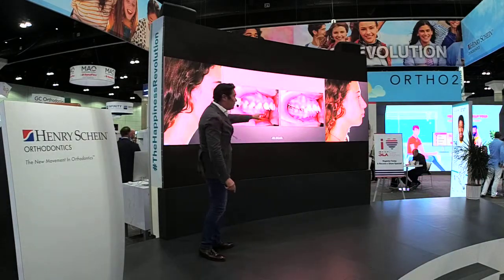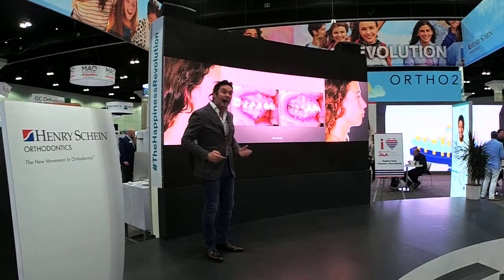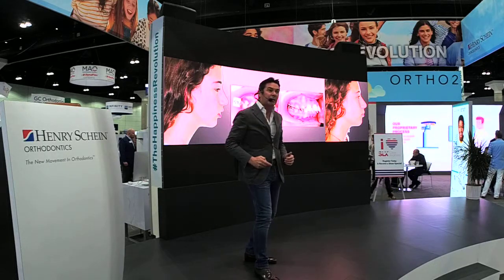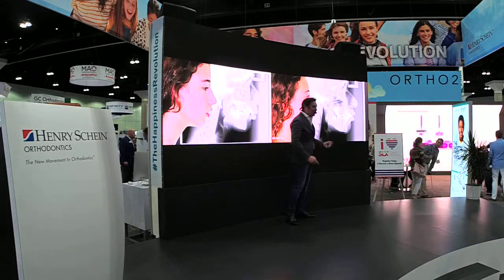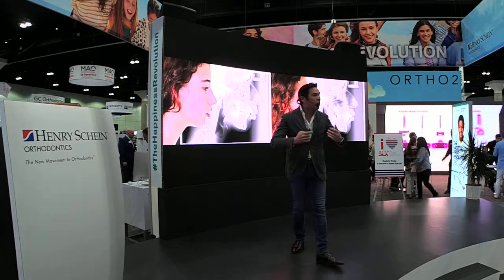Look at the difference of the position of the mandible in a case like this. Now it is balanced. Now the structures are correct. Now the position of the joint is adequate. Now everything is in a correct relation. So this is what we want to accomplish. Now the airway has been expanded, because this bringing forward of the mandible is opening the airway.